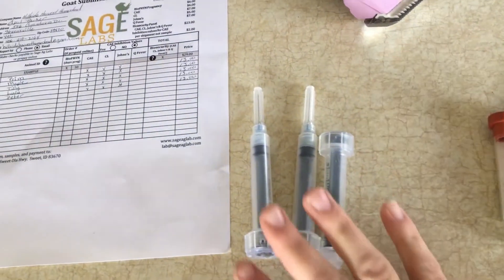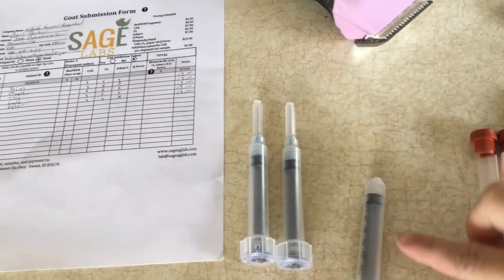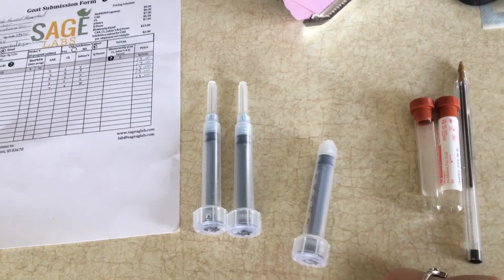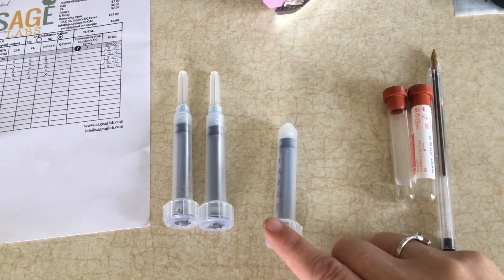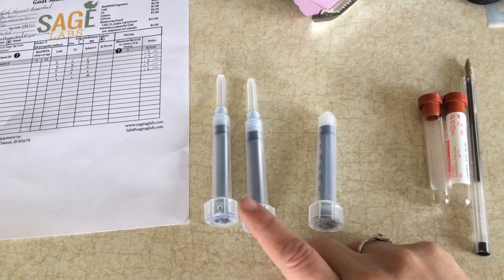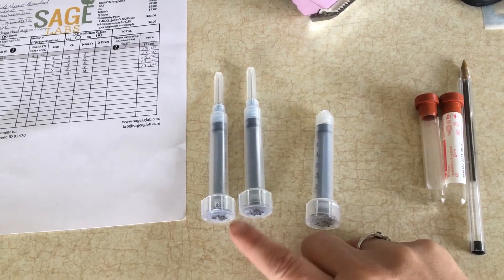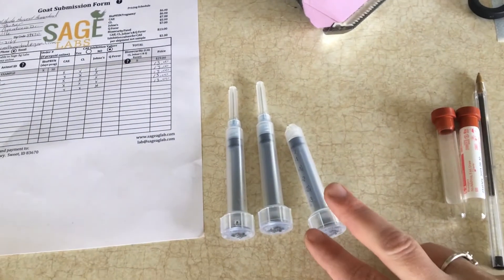I'll show you how I do that. You obviously need your needles — you can buy them at different places. I don't have any individual needles to put on the syringe anymore, as I used them up yesterday. I got 18-gauge needles, and you can use either 18-gauge or 20-gauge. You can also buy them already put together like this.